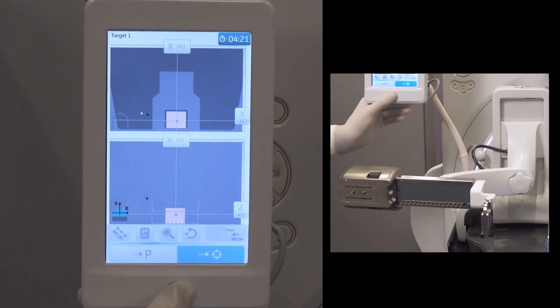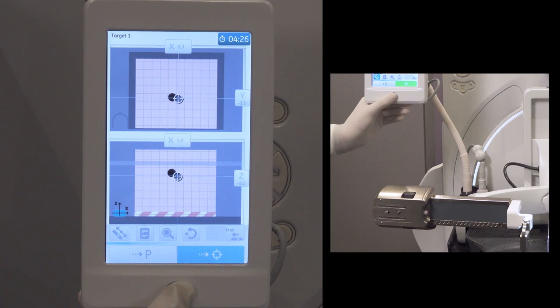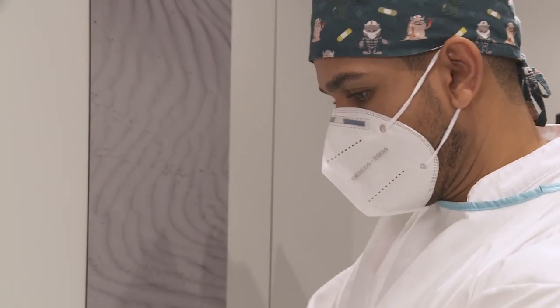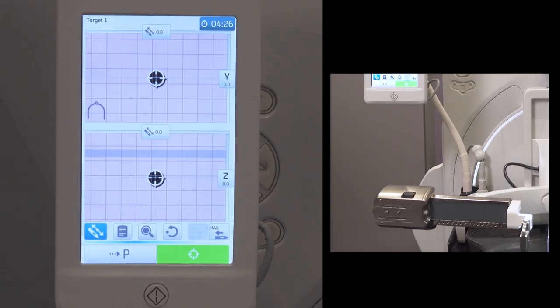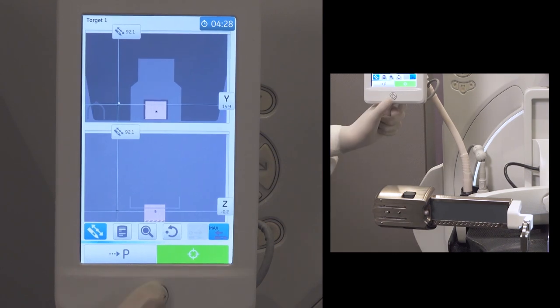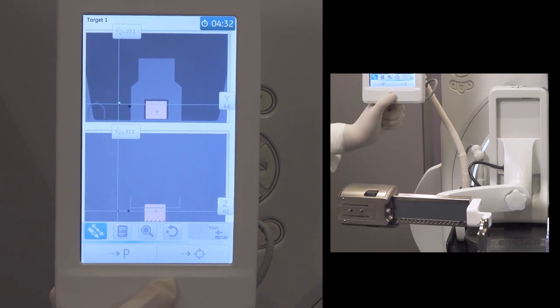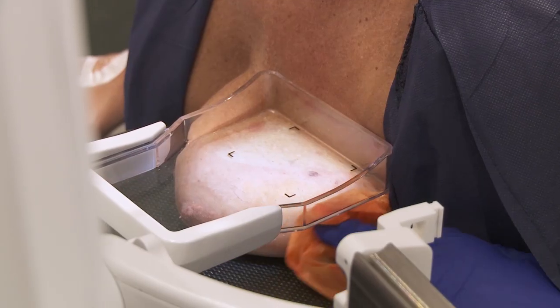From the biopsy display, drive the biopsy head to the target coordinates. Using the max needle preset button, drive the biopsy head backwards while maintaining the target coordinates to free space for anesthesia injection.